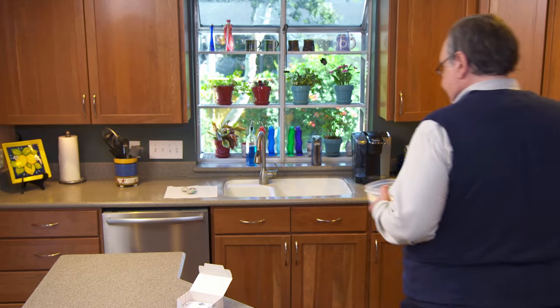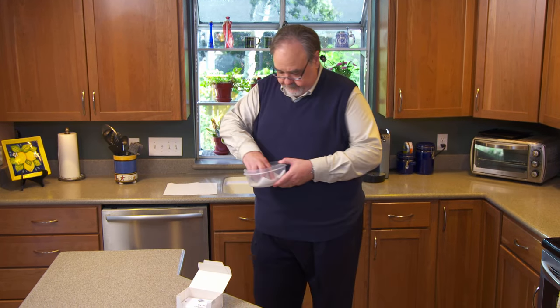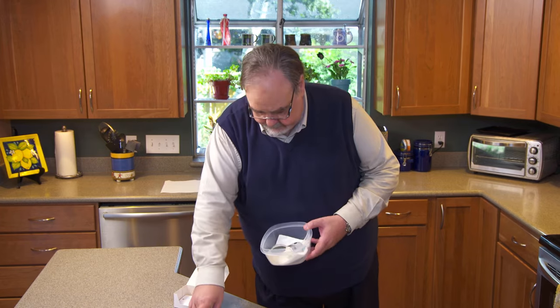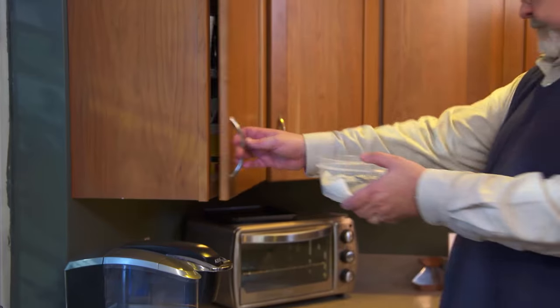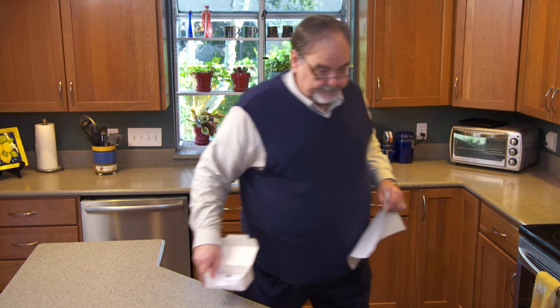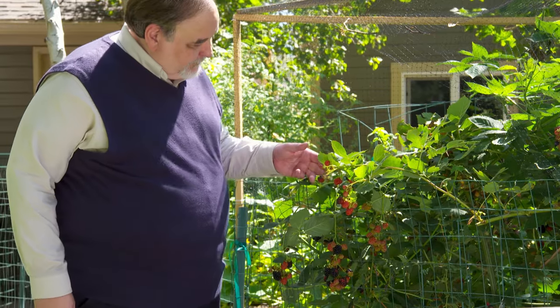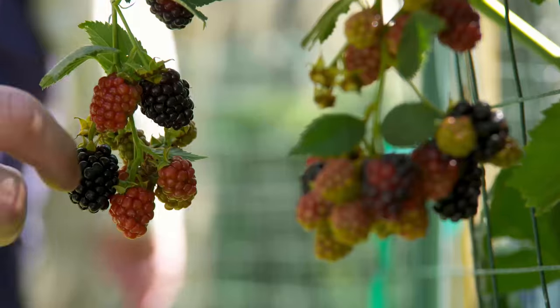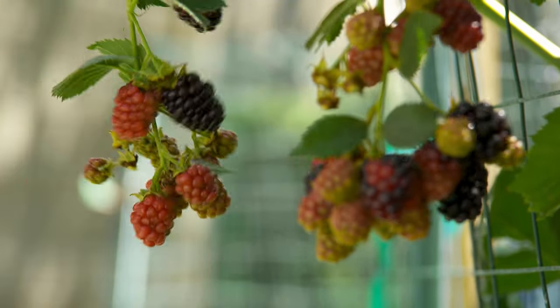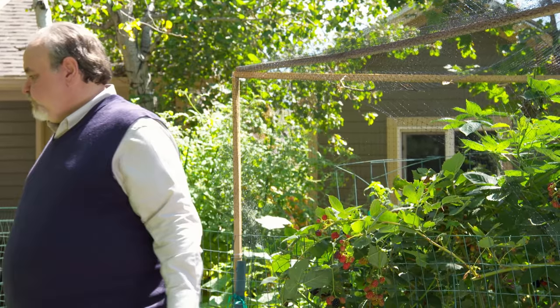Keep the HandiHaler someplace dry that stays at a comfortable temperature. A kitchen cabinet might be a good spot — it won't get too hot or too cold, it stays dry, and it's up and away from children and pets. When you follow the steps we've shown you today, the HandiHaler will do exactly what it's supposed to do: deliver the right amount of medicine every time, to help you breathe easier.